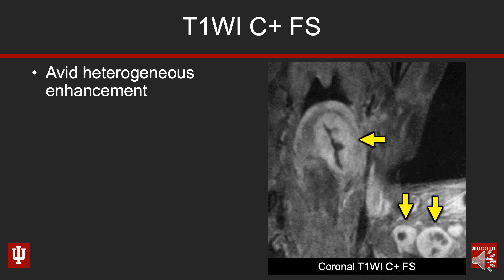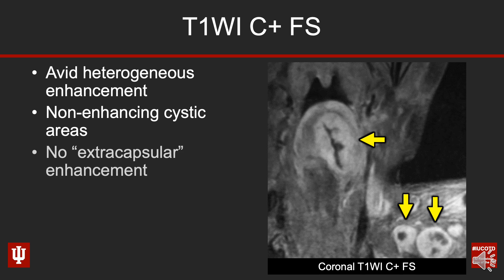Lastly, we have the coronal T1 post-contrast fat-saturated images. These masses were avidly but inhomogeneously enhancing — the areas that were T2-bright, the cystic or necrotic areas, are non-enhancing. Also keep in mind, looking at the margins and morphology, we don't see any extracapsular enhancement or infiltration into surrounding soft tissues. These look circumscribed and well-behaved.